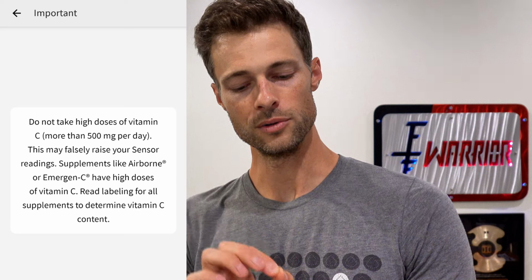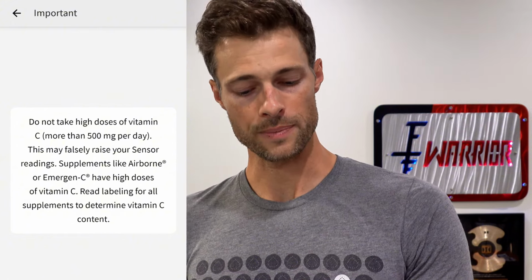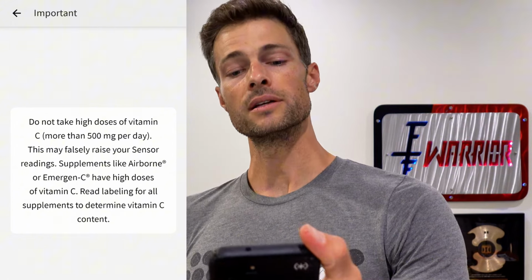So I'm gonna hit next again. This is an important one for you guys. Do not take high doses of vitamin C, more than 500 milligrams per day, on the Freestyle Libre 3. This may falsely raise your sensor readings. Supplements like Airborne or Emergen-C have high doses of vitamin C. Read labeling for all supplements to determine vitamin C content.